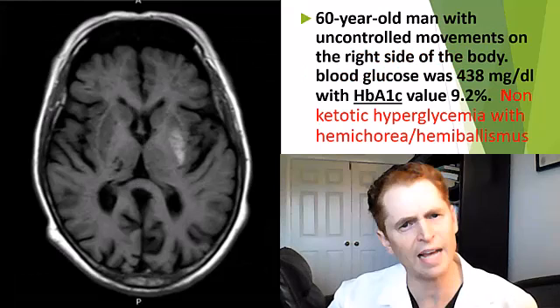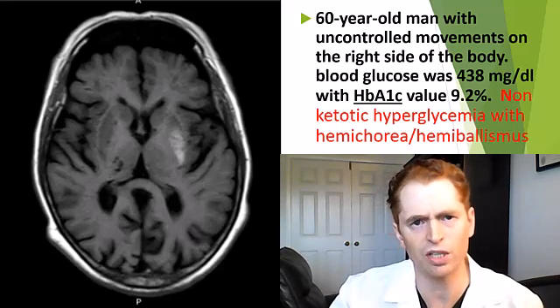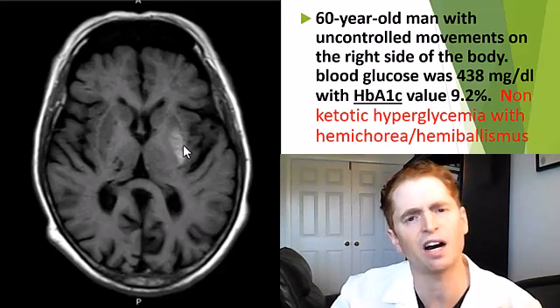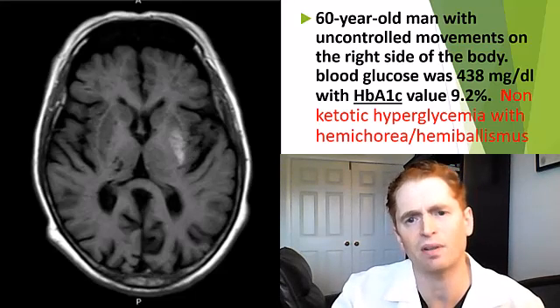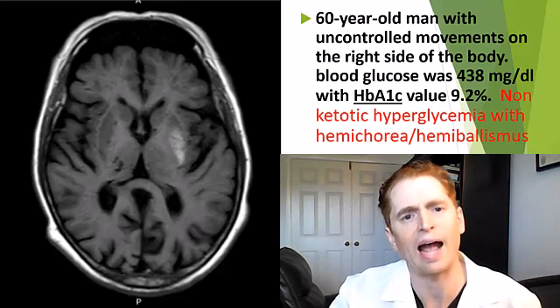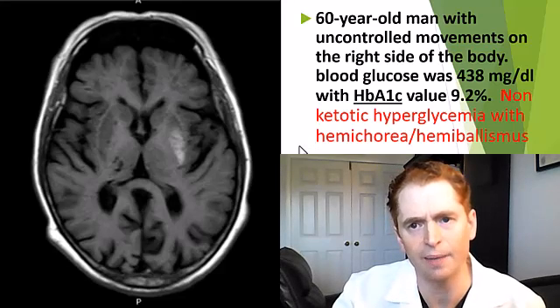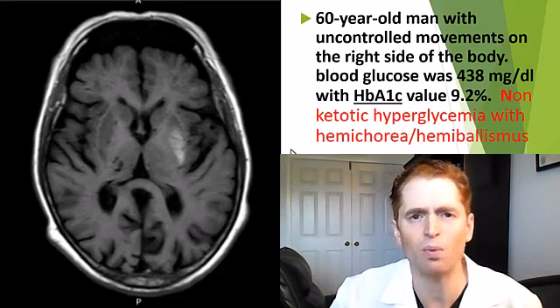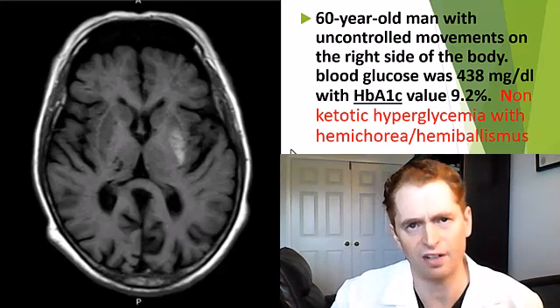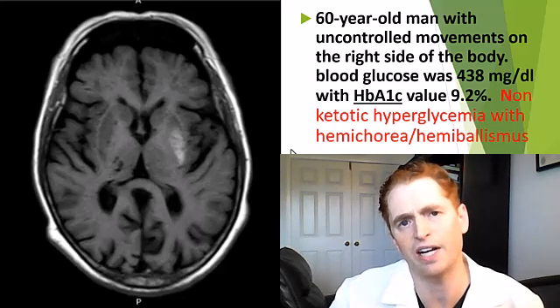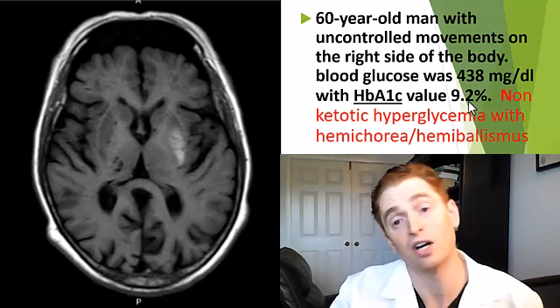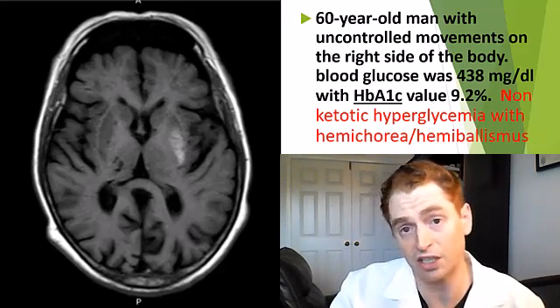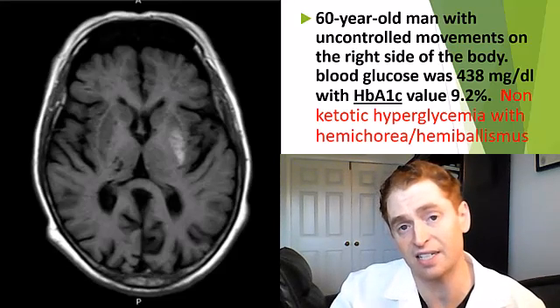This is the MRI of the 60-year-old man with uncontrolled movements on the right side. In the left putamen, there is a bright T1 signal consistent with non-ketotic hyperglycemia with hemichorea and hemiballismus — abnormal movements on the contralateral side of the body due to very elevated blood sugars causing toxicity. In my experience, this disease more commonly occurs with blood glucose over 500 and hemoglobin A1c around 14–15; the 9.2% value here is quite low. Bright T1 lesions in the basal ganglia can also occur in carbon monoxide poisoning or manganese toxicity.